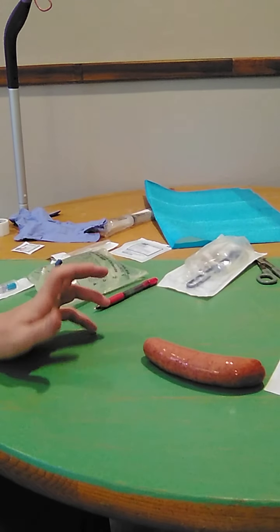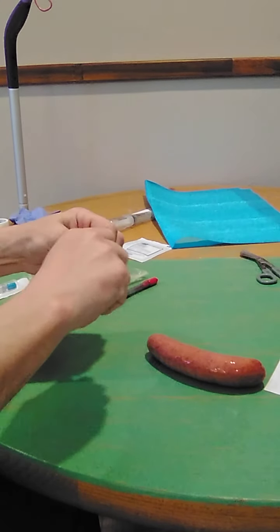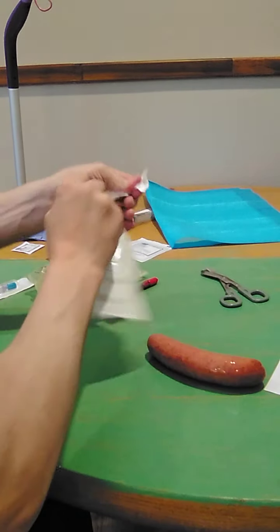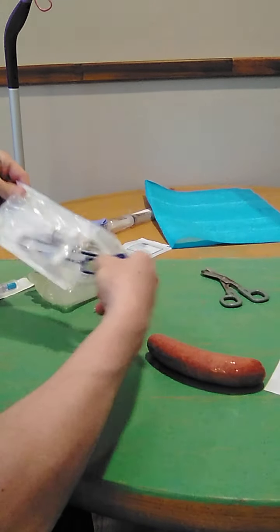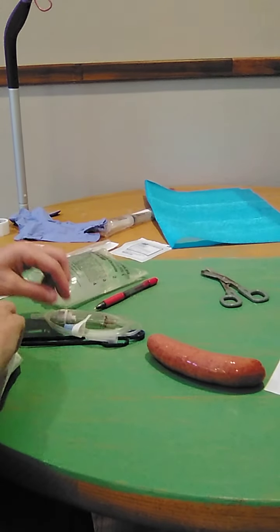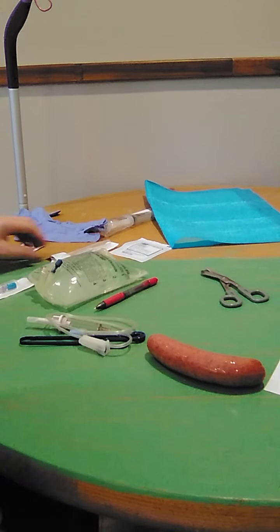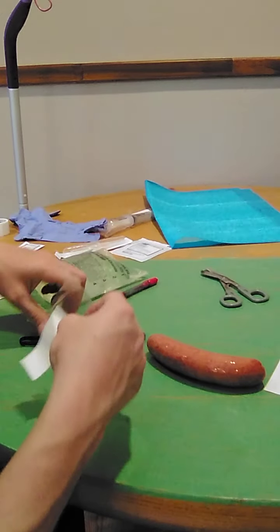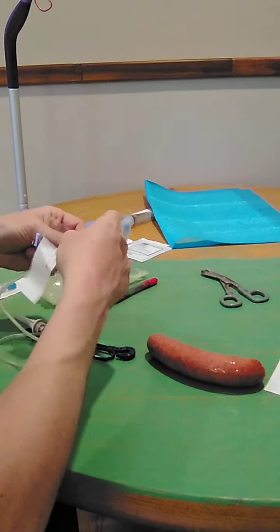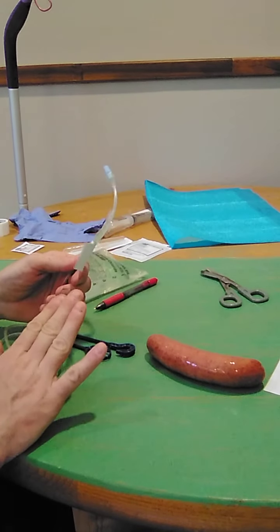So now I'm going to get the appropriate administration set and remove that from its packaging. So I'm going to label this IV line with today's date and the time, and when this infusion is initiated, and my name.